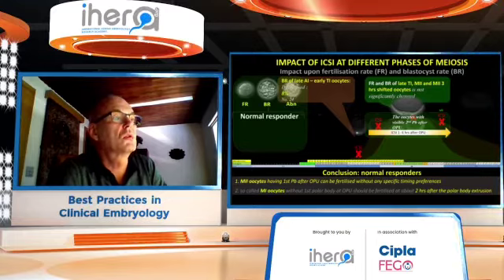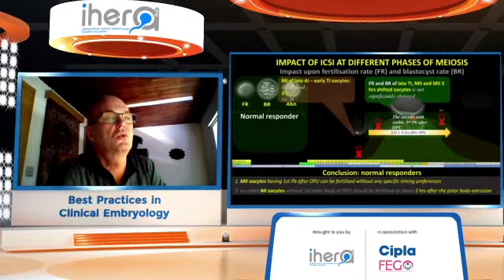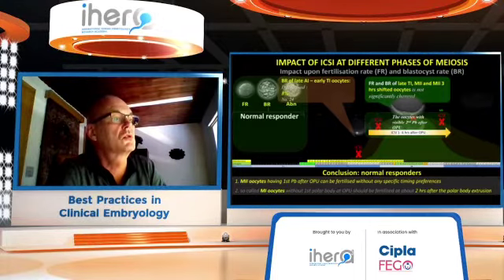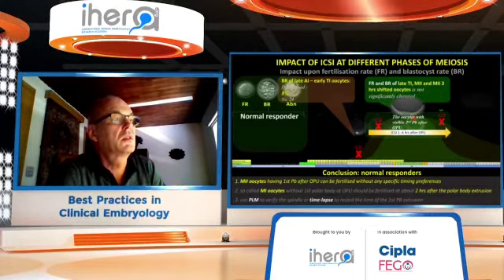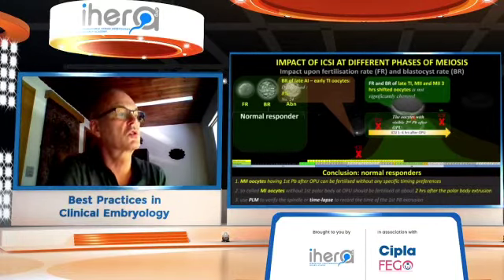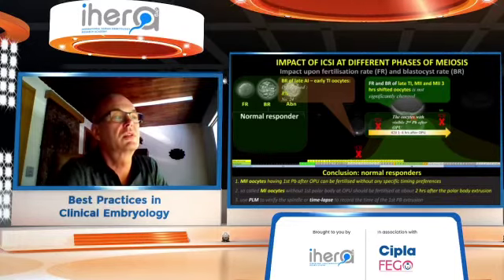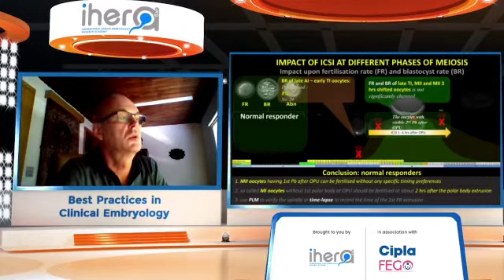So-called M1 oocytes without a first polar body at OPU should be fertilized at about 2 hours after the polar body extrusion. And the third one, use polarized microscopy if you can to verify the spindle, or time-lapse recorded time of polar body extrusion.